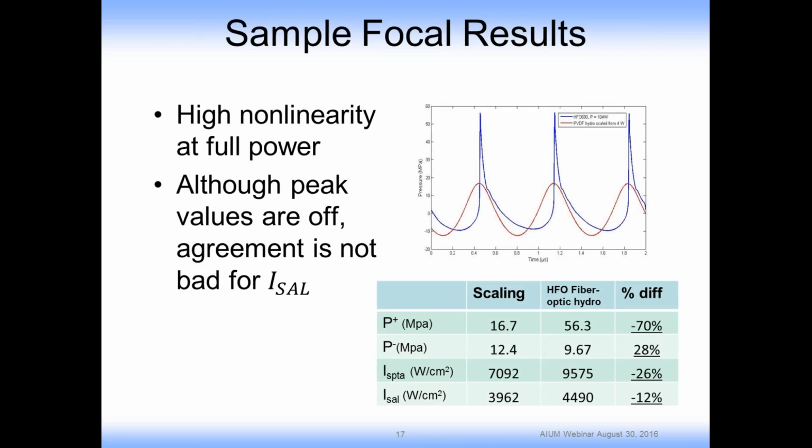So I want to give some example results. The blue curve here shows the result from the hydrophone, which actually also agrees with simulations, I should mention. So we have trust in this shape and form. Basically what you see is that in reality in water, the waveform is distorted. You see a high amplitude positive pressure and the negative pressure is not so high. On the positive end, it's narrow. This is what is called a weak shock wave, effectively.